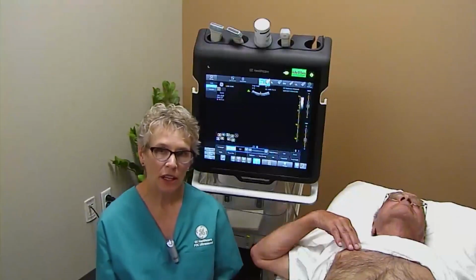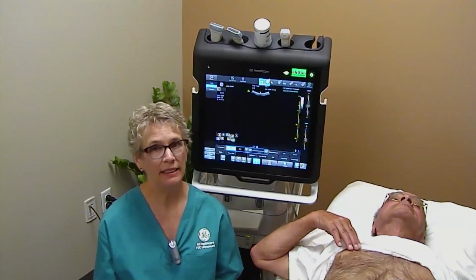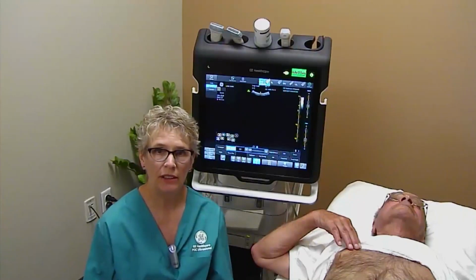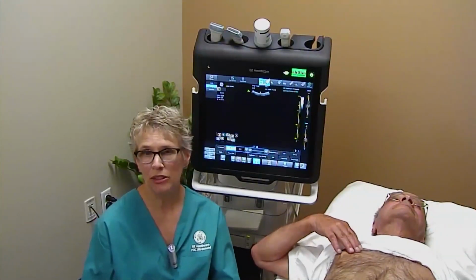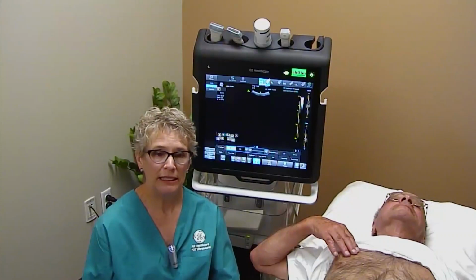Okay, so we've already talked about the definition of B-lines, and we've talked about some of the other lines that you might see, A-lines and Z-lines. Now let's talk about the presets for B-lines. It's so important. As I mentioned before, we need to understand that the settings are appropriate to show B-lines. Some of the settings that we're used to in regular ultrasound scanning can actually interfere with our ability to see the B-lines properly and actually count them accurately. So let's take a look.